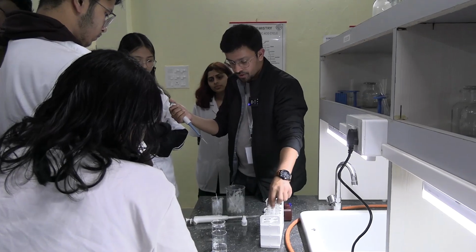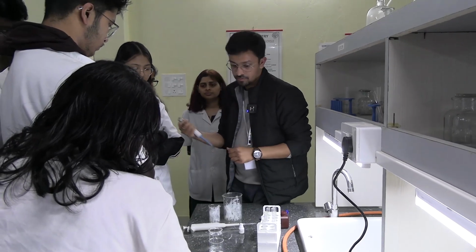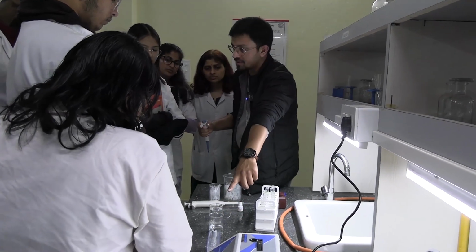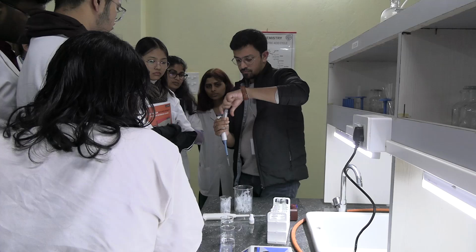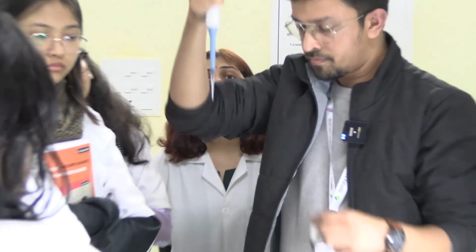Mix it, keep it for the test. Okay, now there are 2 types of test sample given. One is, this is our lab made samples. Okay, and this is the real blood sample. Okay, if you're taking from the real blood sample, sample done.